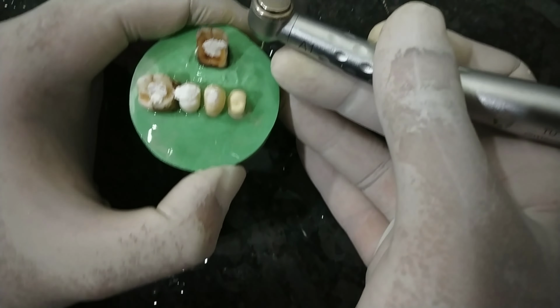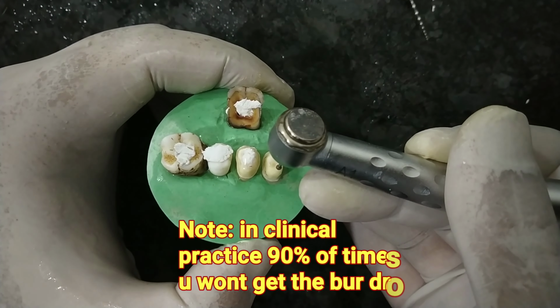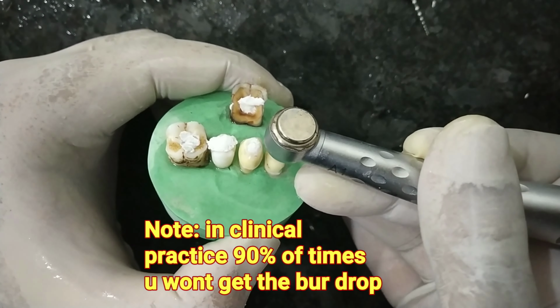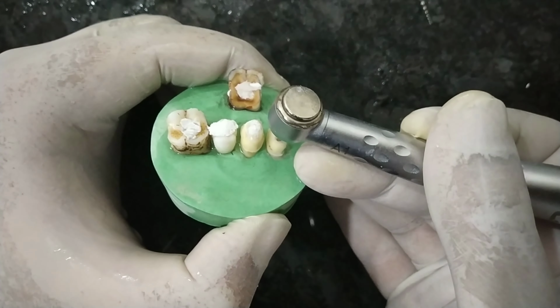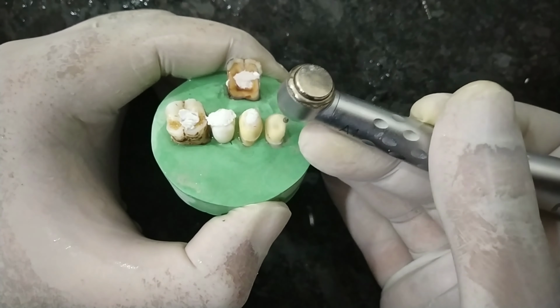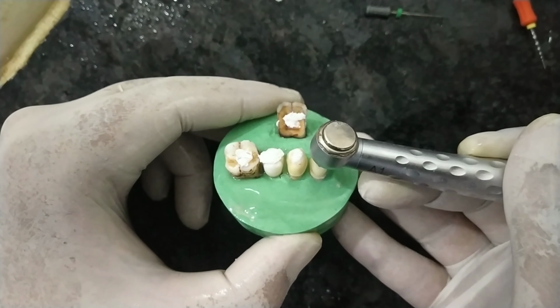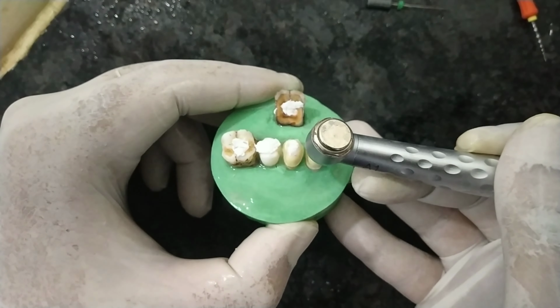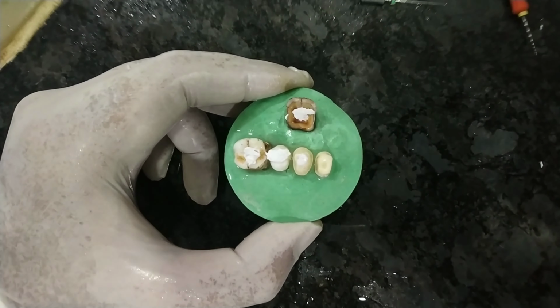So at one point you will get the bur drop. Till now I have not got the bur drop. But again I will try it one more time. Yeah, it's done now. So I have achieved the bur drop. Now I will show you.